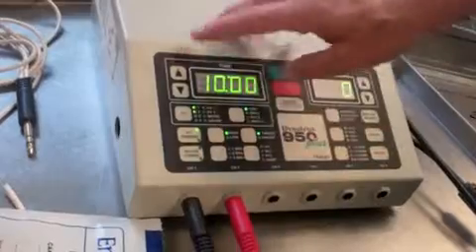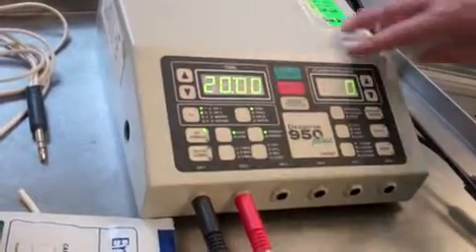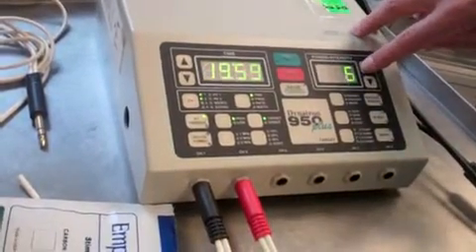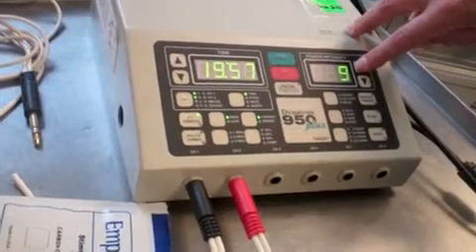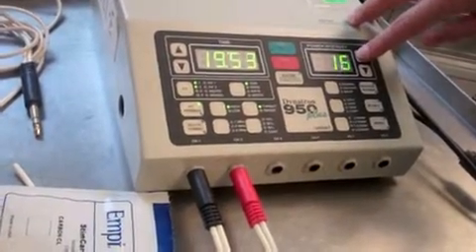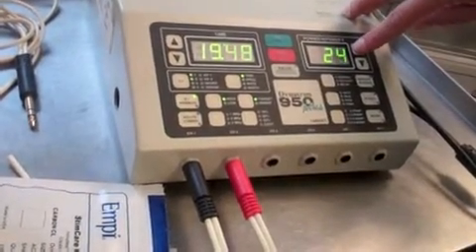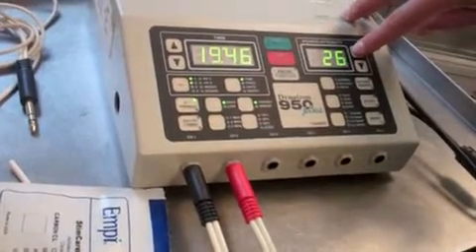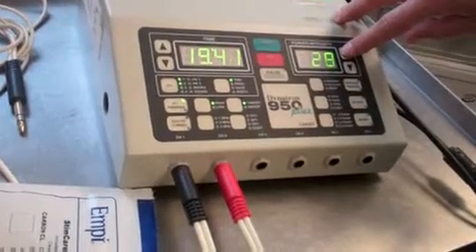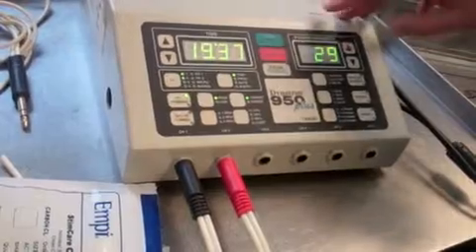We're back to our time — typically we'll treat for 20 minutes. We start to increase the intensity where the patient says that they feel a buzz or tingling sensation. He's saying he feels it now, and we'll go up until it's comfortable or until he says it's uncomfortable, and then he can back it off a little bit. That's where it will sit.